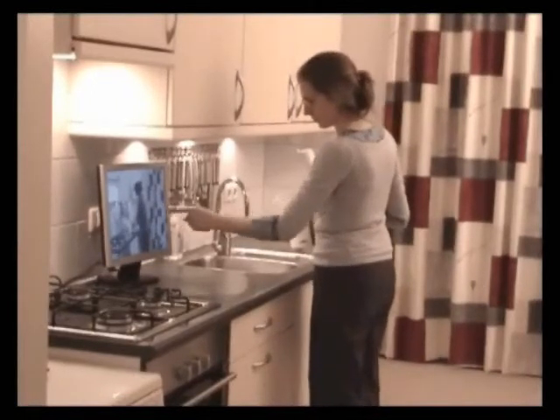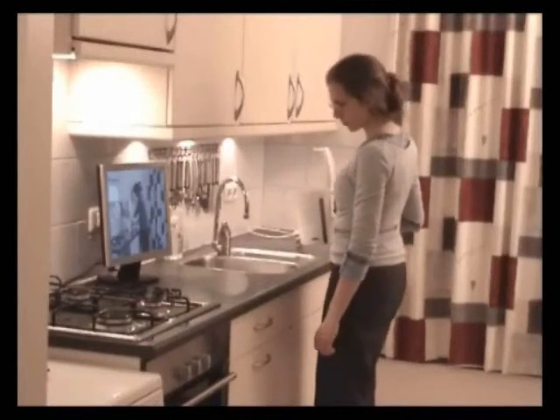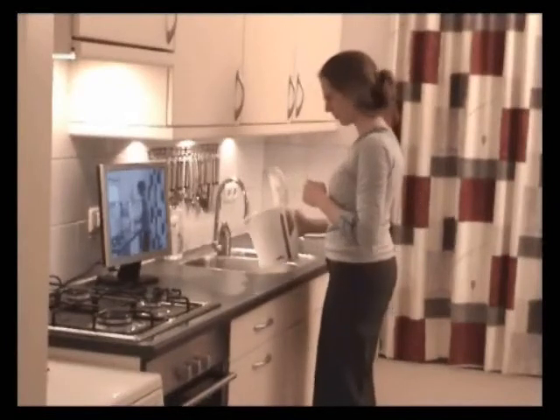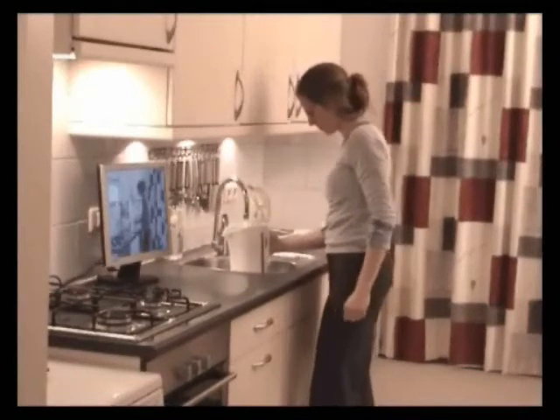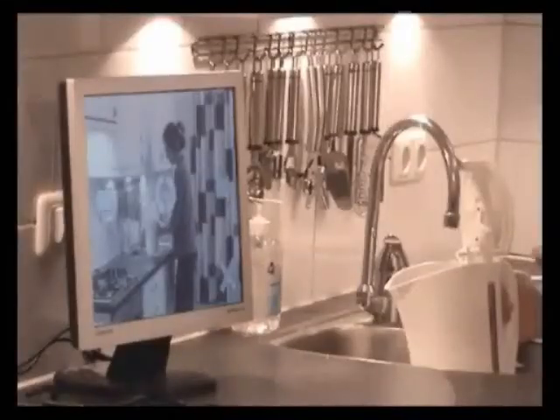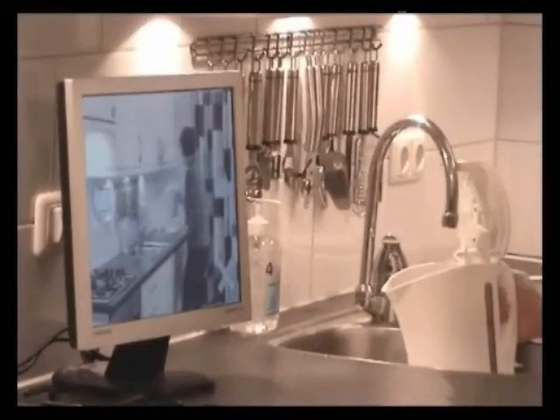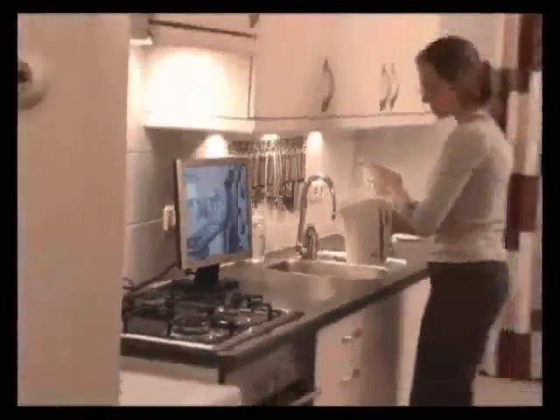The kitchen area of this person has been equipped with a touch screen, through which all explicit interactions take place. In addition, sensors have been installed in cupboards, drawers, and several household appliances. These sensors provide implicit feedback about the person's actions. When a person with dementia requests activity assistance, the screen provides both visual and auditory instructions about the task at hand. To ease recognition, instructions feature the person herself, performing the task in her own environment.